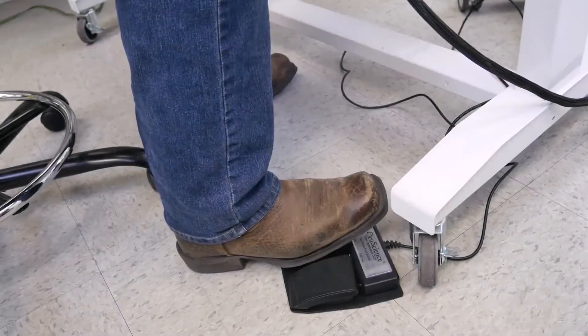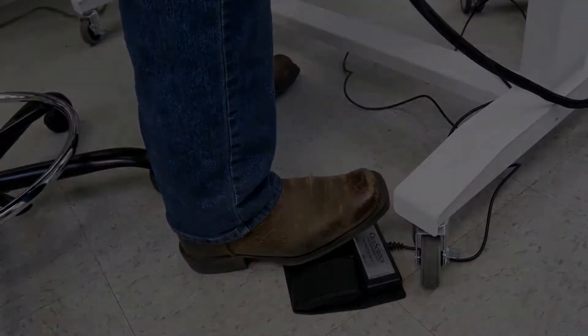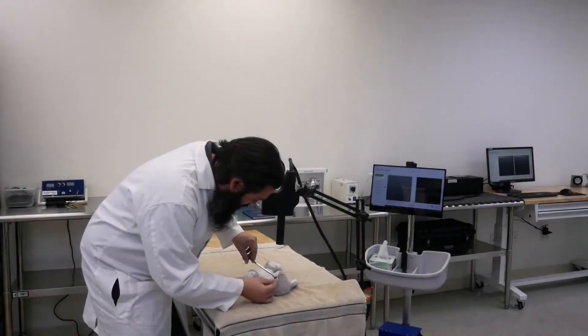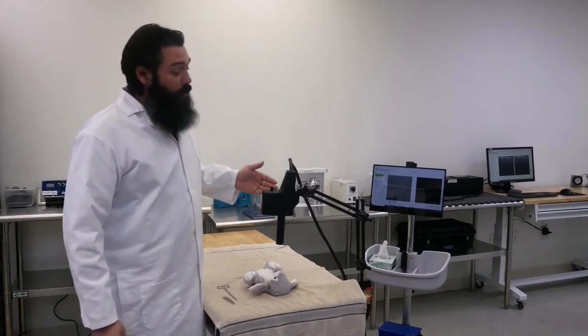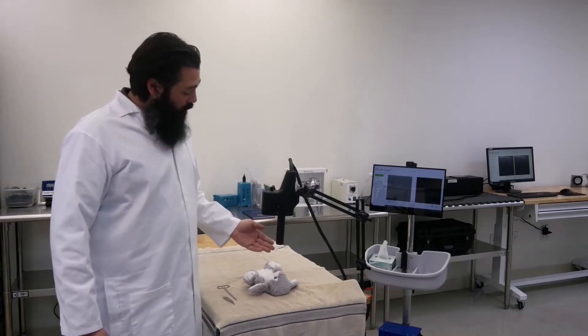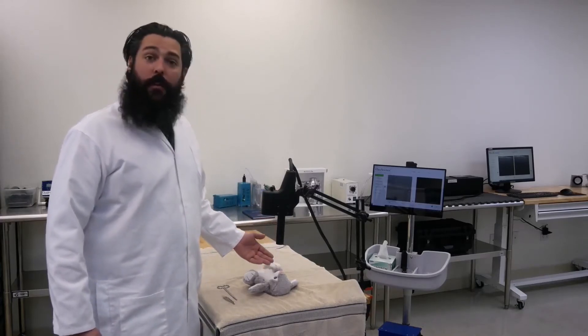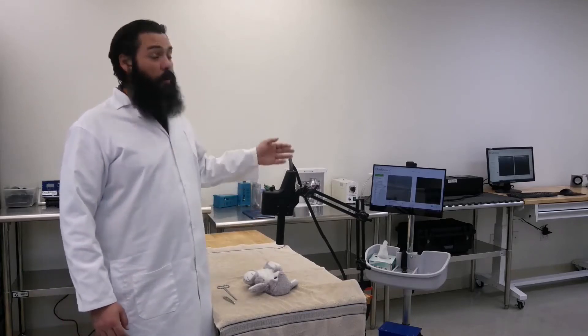The foot switch makes it easy to capture images while keeping your hands available to manage the patient. We've mounted our scanner head to an articulated arm and added our surgical optic. The 12.5 centimeter standoff will increase our working distance while enabling a range of operations while viewing the cornea on screen.